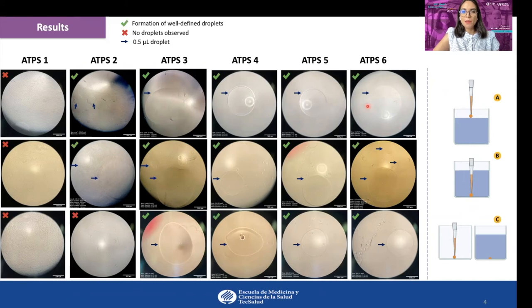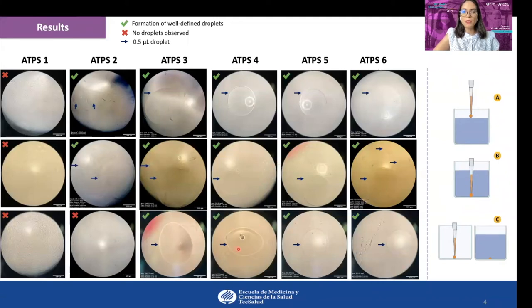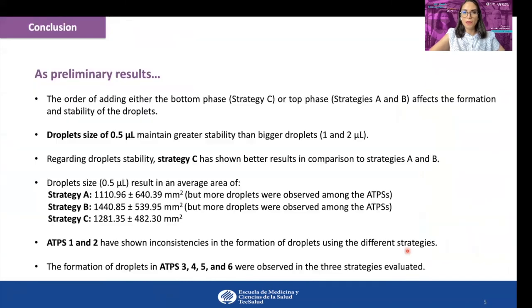The same outcome is observed in strategy B. However, the presence of other small droplets is also observed in both strategies. For strategy C, one defined droplet is observed in the same ATPs. Comparing the three strategies, strategy C seems to promote greater droplet stability.